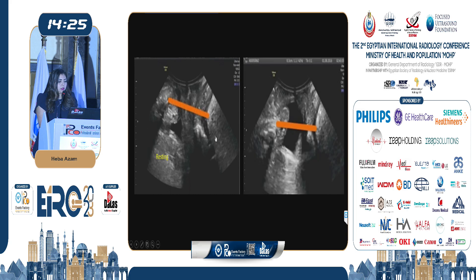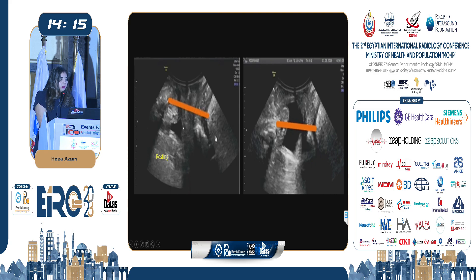In this case, the left image is during resting and the right image is during straining. Anteriorly, the symphysis pubis and the reference line are visible. We can identify the bladder neck, urethra, vagina, anal canal, and rectum, as well as the puborectalis muscle.